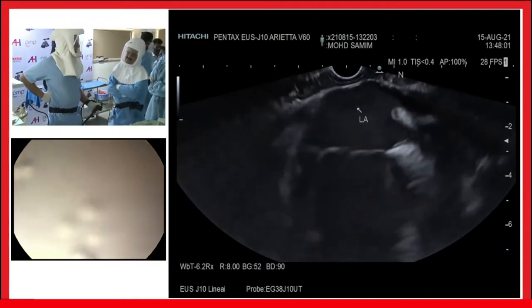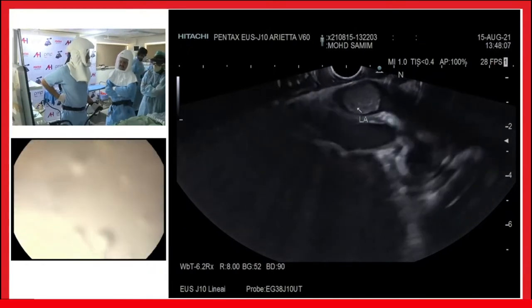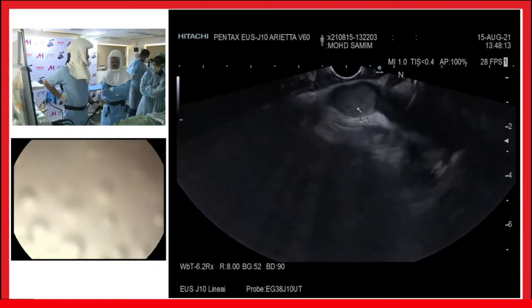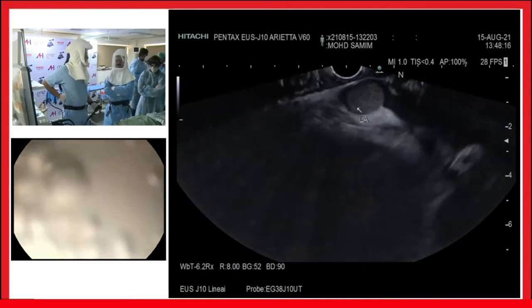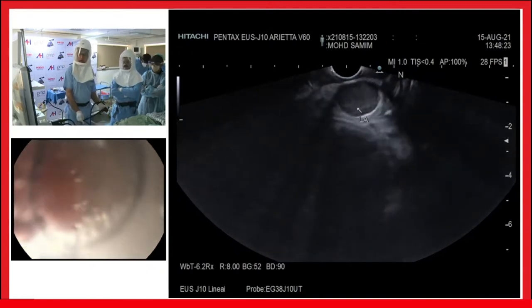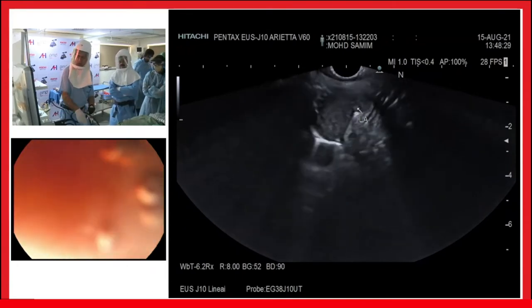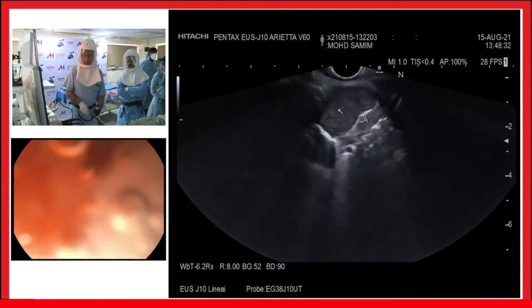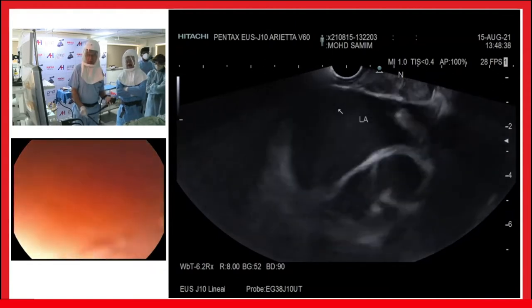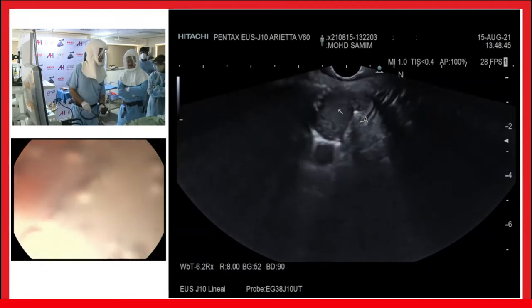But can lung cancer invade the cardiac chambers? What is the possibility of invasion of a cardiac chamber? What I remember, cardiac invasion is very, very rare. So is it a very rare cardiac invasion of lung cancer that we are seeing? But keep on thinking, because as I rotated this a little bit left, suddenly I find that this mass seems to be dividing into two. So this is not a mass which is within the left atrium. The left atrium is clear. This mass is within the left pulmonary veins, within the branches of the pulmonary veins.